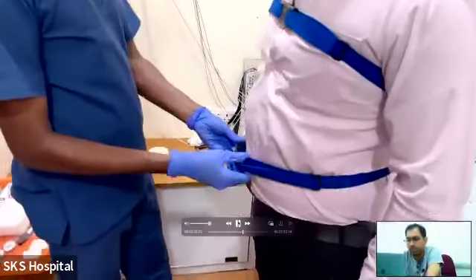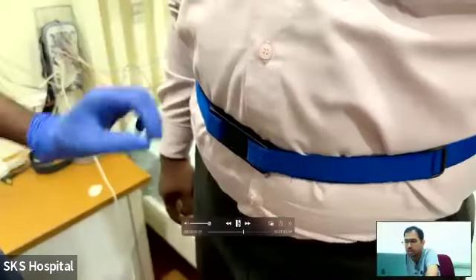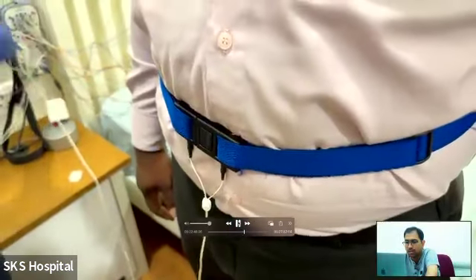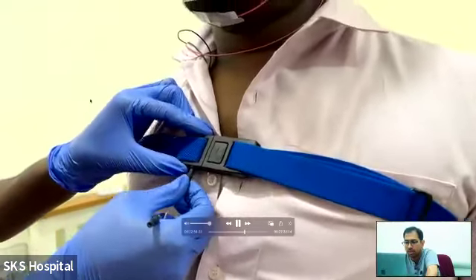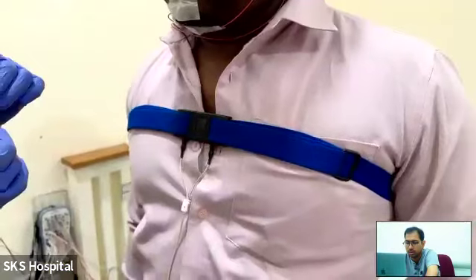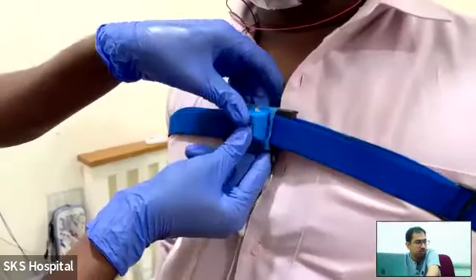Too tight or too loose just comes with practice. There is no specific method for how tight or how loose it should be, but a simple reference is that 2 fingers can be slipped in easily. So these are the RIP belt connections, where we connect on either side of the belt, and the main sensor goes to the head box, as you can see on the left corner. The thoracic belt is connected in the same way. This is the position sensor, as I showed earlier. This is to see whether the patient is supine or in a lateral position.